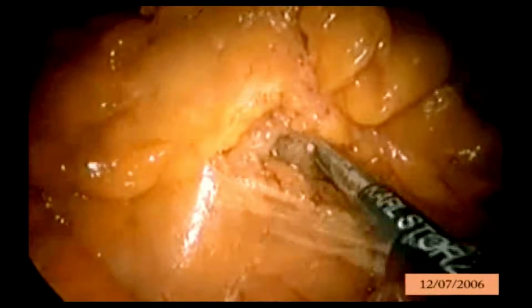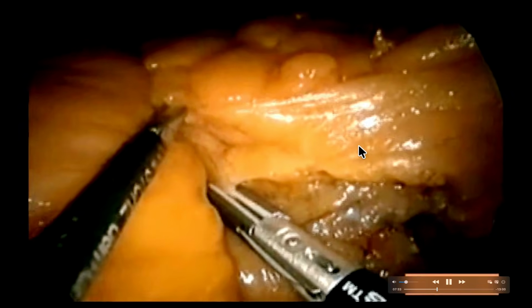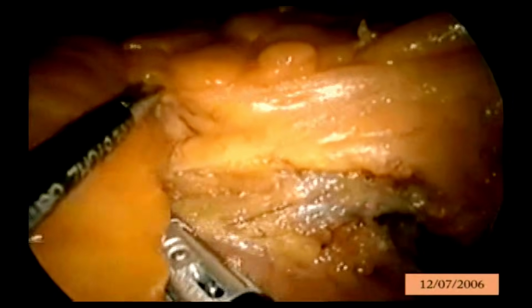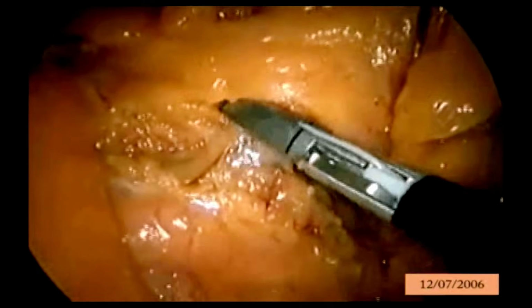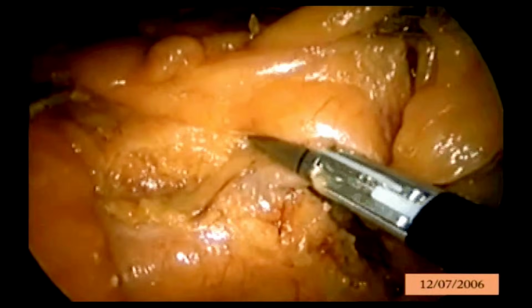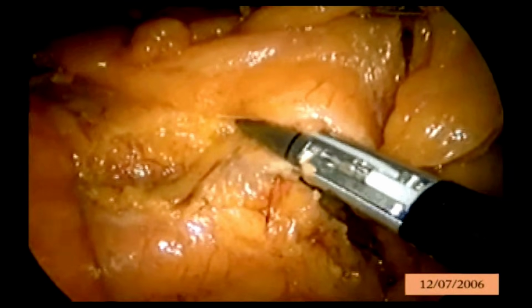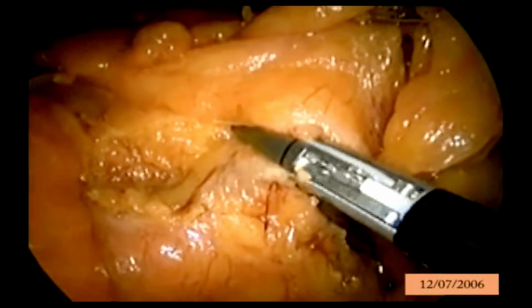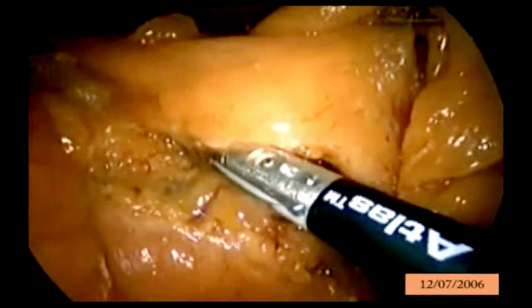So you can see how easy benign colorectal surgery is. Directly, the LigaSure can cook the mesentery, one jaw inside, another jaw outside the mesenteric window, and directly all these marginal arteries can be sealed by the LigaSure. And do you know, fat is the best medium for coagulation. You cannot see any smoke.